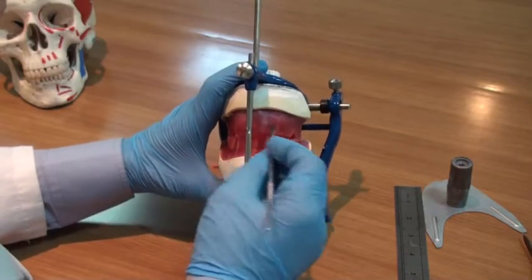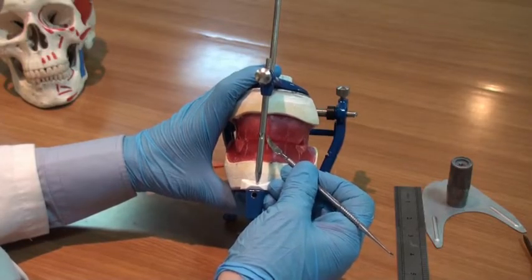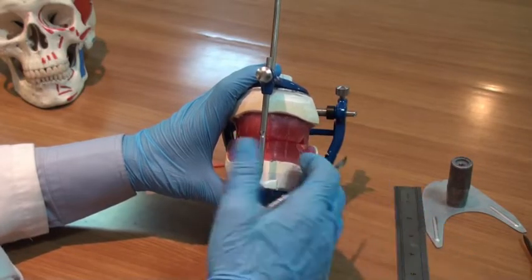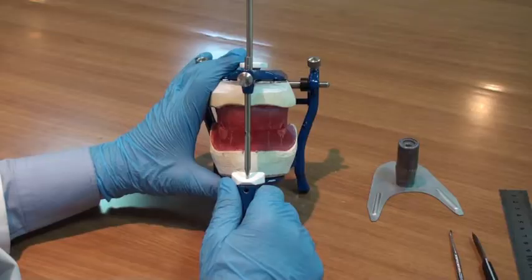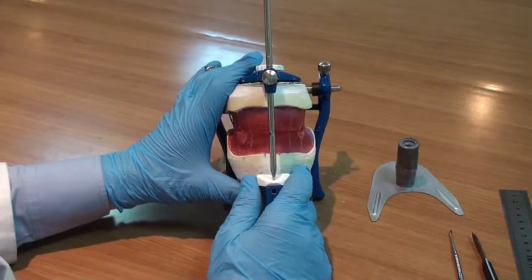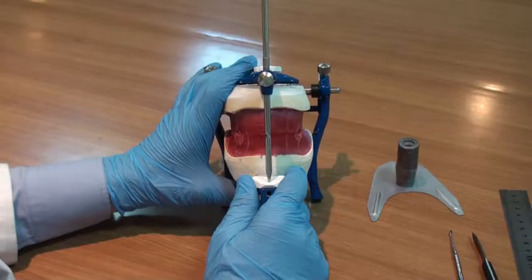Now, artificial teeth will be set into the wax surface, so it will give us the exact amount of lip support and buccal corridor exactly as the customized wax rim inside the patient's mouth. The fourth determinant, or information transferred from the patient's mouth to the articulator via the occlusion wax rim, is the proper placement of the occlusal plane.